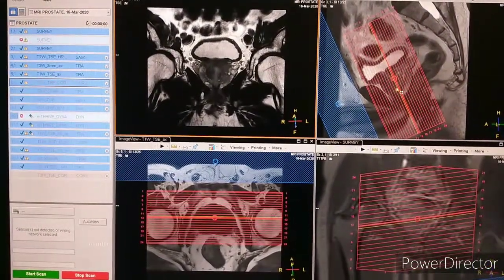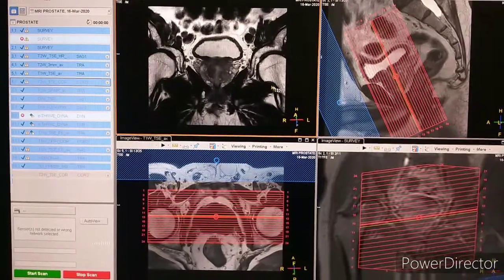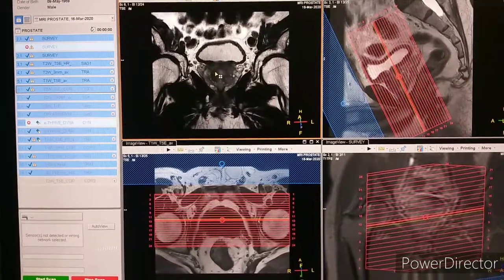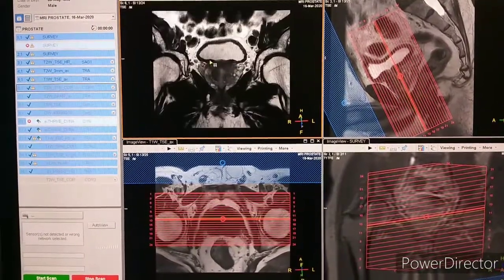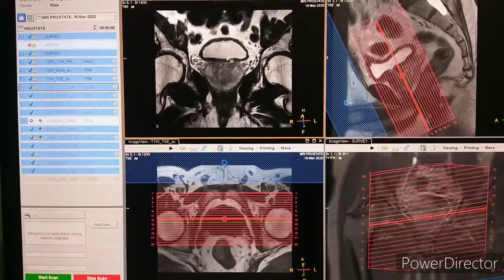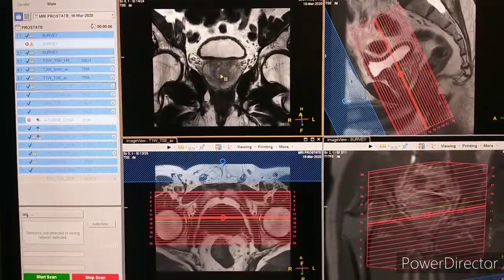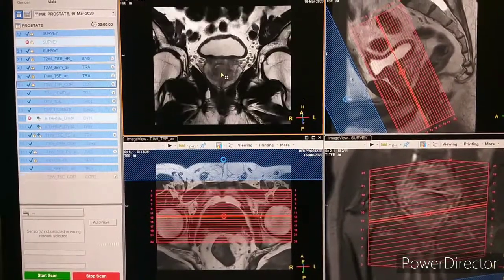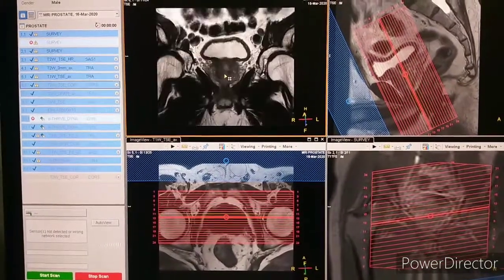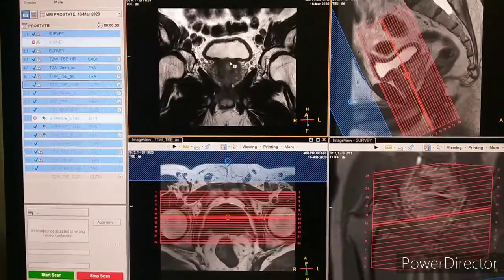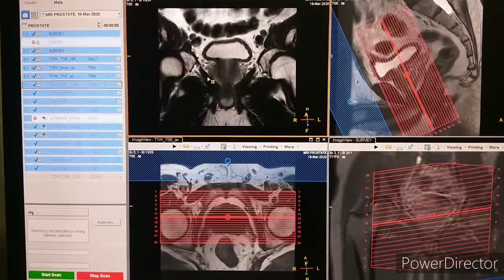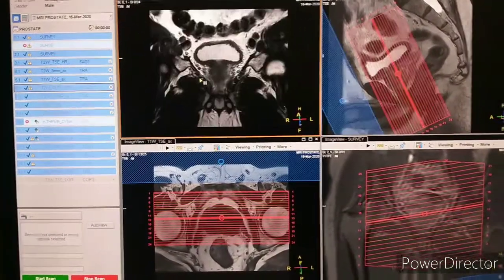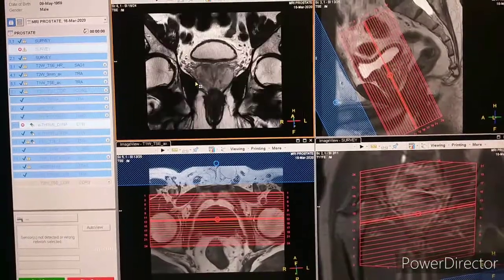The coronal planning is parallel to the urethra. This is the prostate, this is the urinary bladder. So the coronal sequence is planned parallel to the urethra, and this is the prostate.